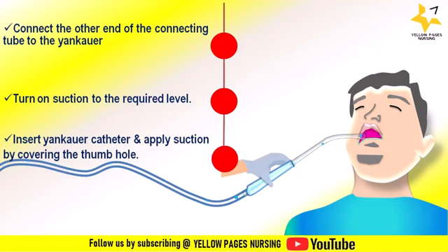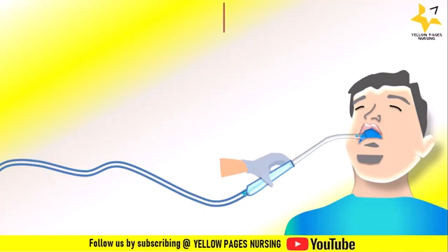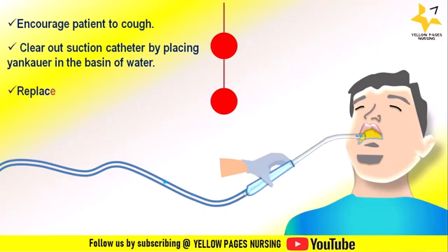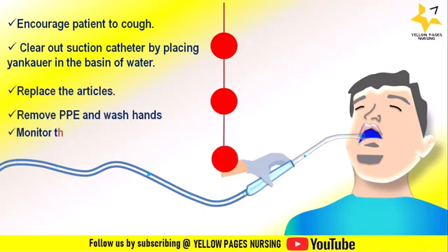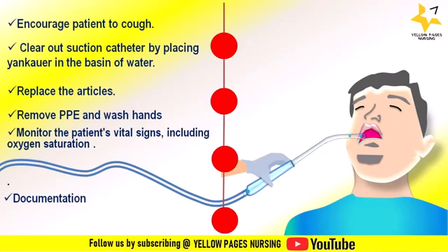Test the function by covering the hole on the Yankauer with your thumb or index finger over a small amount of saline. Insert the Yankauer catheter and apply suction by covering the vacuum control port with the thumb or index finger. Insert the catheter along the gum line to the pharynx in a circular motion, keeping the Yankauer moving. Encourage the patient to cough. Clear out the suction catheter by placing the Yankauer in a bowl of water. Replace the articles, remove PPE, wash hands, and monitor the patient's vital signs including oxygen saturation. Document the date, time, and pre- and post-respiratory status.